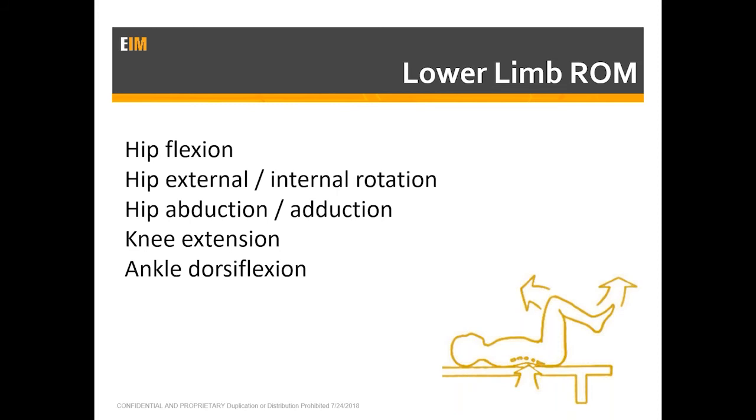Make sure that if you've got 90 degrees of hip flexion and you're sort of to midline with their lower limb, that you all of a sudden haven't moved that rotation or that obliquity up the trunk. All of a sudden, man, they're really rotated at their trunk, or they've got a scoliosis that's developed. Okay, we want to see if you can get that pelvis in neutral and 90 degrees of hip flexion without affecting the trunk at all.